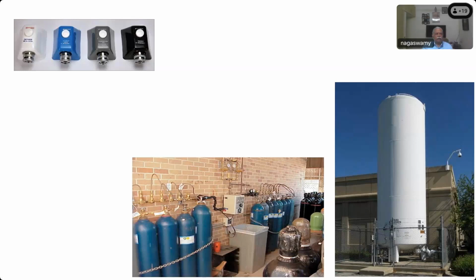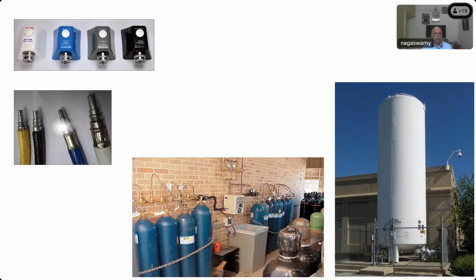What are all the safety features you see in this? Diameter index safety system, color coded. Non-interchangeable screw thread, sir. Diameter index safety system is one which you have to screw. This is called non-interchangeable probes, not screw thread. There is no thread or anything. You just push it inside.